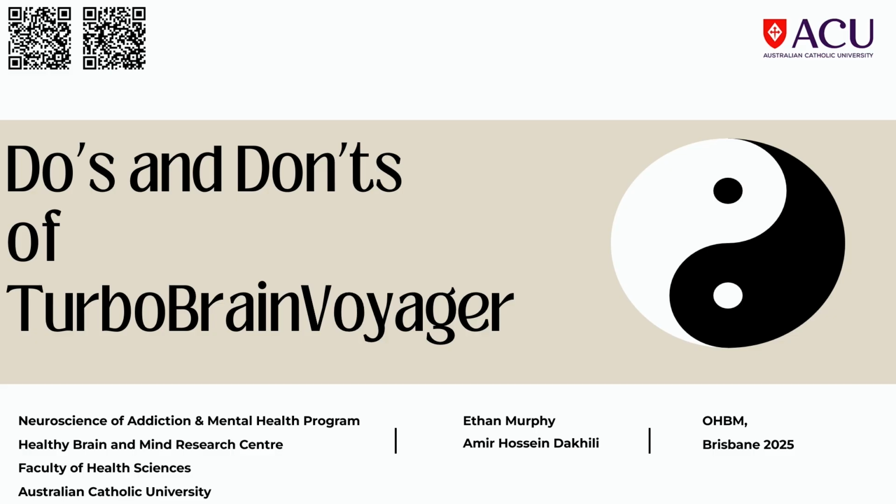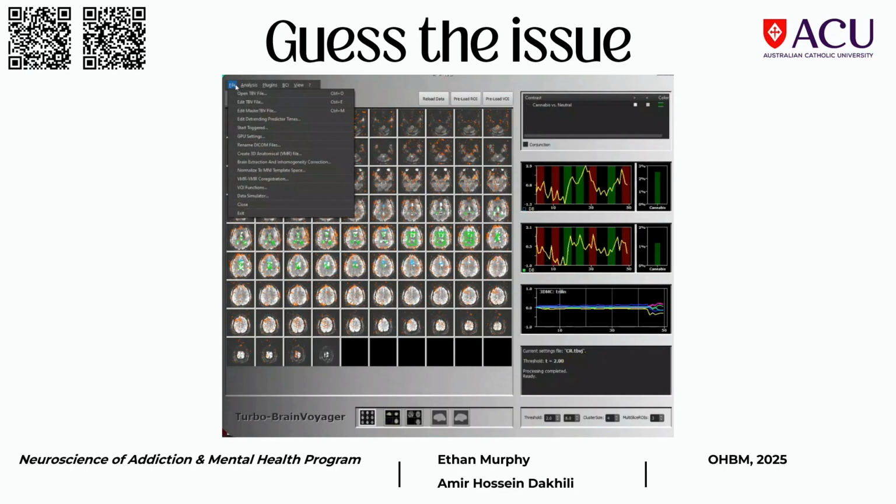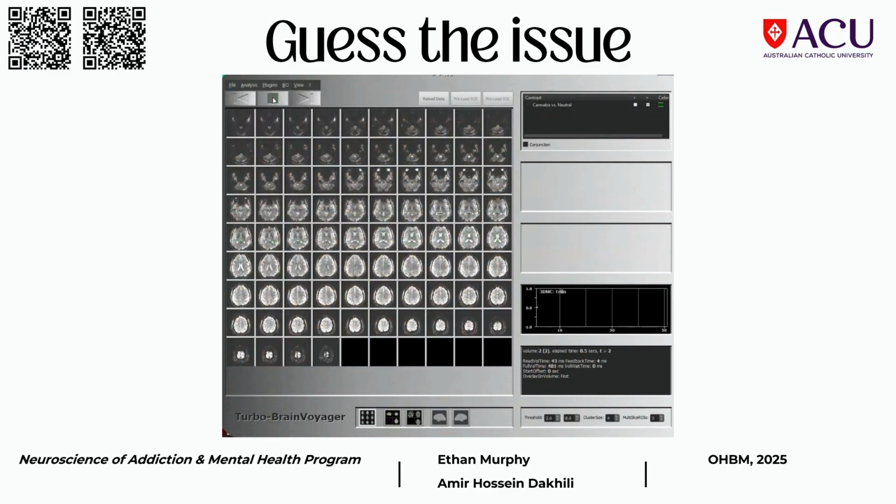Okay, so yes, there are going to be a couple of videos, like some of them that we showed earlier, and probably you can guess what went wrong. We can start from this one. So this shows that a neurofeedback experiment has already been started, but do you think that everything is going right in this demonstration? You can shout out if you think you know what's going wrong. And I'm going to throw a caramel koala at you.